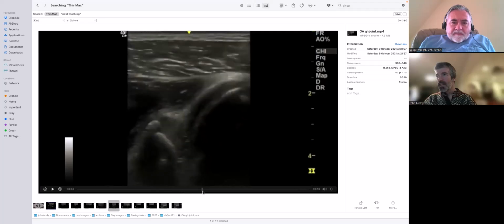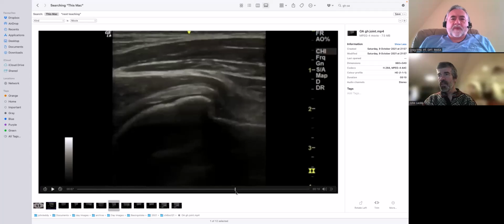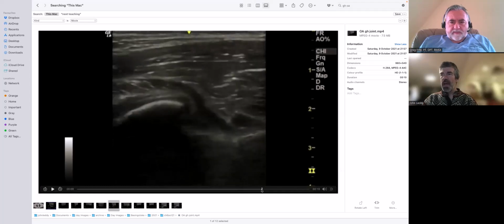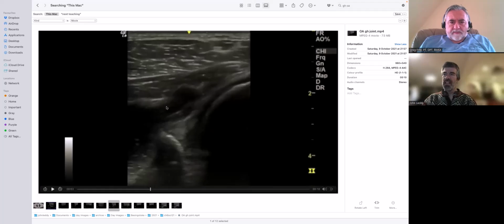So let's have a look. Yes, this is the inferior margin there, the glenohumeral joint. So this is looking in the armpit, scanning up through, and you just see this clunky appearance here. And there we do see it in the back of the joint, and that's where I certainly have looked for it in the past, and just the abnormal shape of the glenoid there. The back of the joint, meaning posterior, and you're approaching it with the arm at the side. Yes. So that's there.